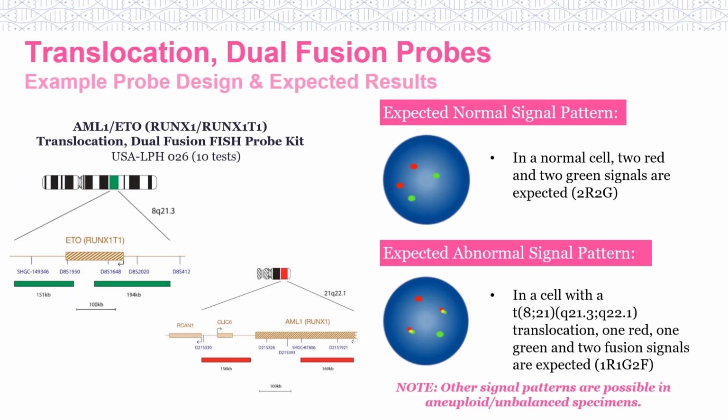The fourth specific sequence probe design strategy we will review is for translocation dual fusion probes.